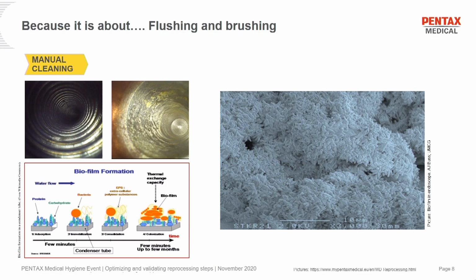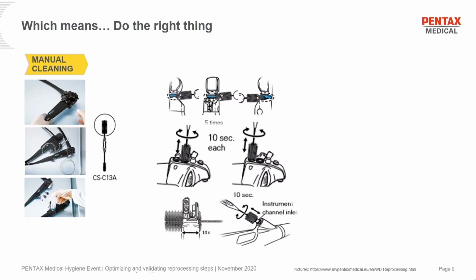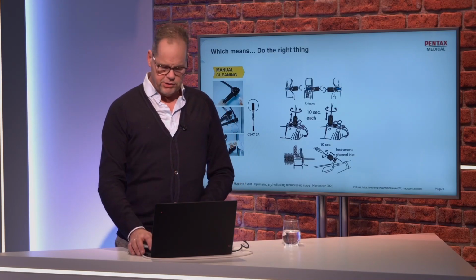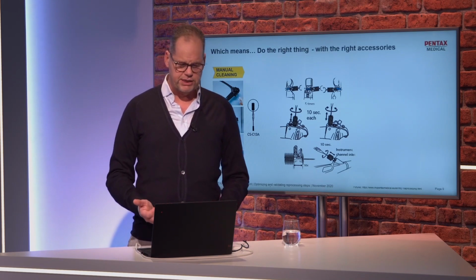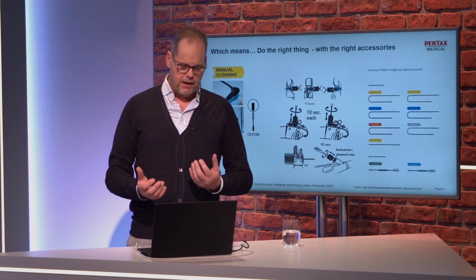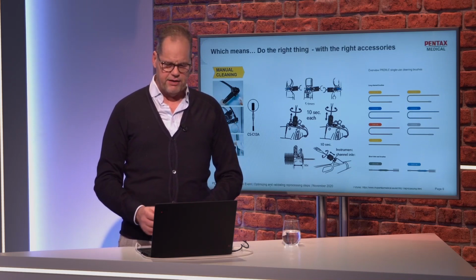And the advice would be to reprocessing staff, but also to doctors and nursing, if you have the opportunity to have a look inside the endoscope, please do it. And I hope you will not see this one, because this is not good. This is a biofilm. Doing the right thing means also doing the right thing with the right accessories, with the right brushes, the right materials, and the right IFUs, of course.